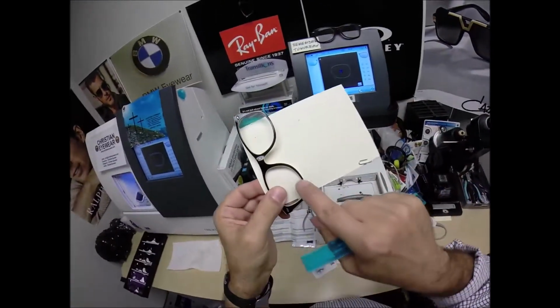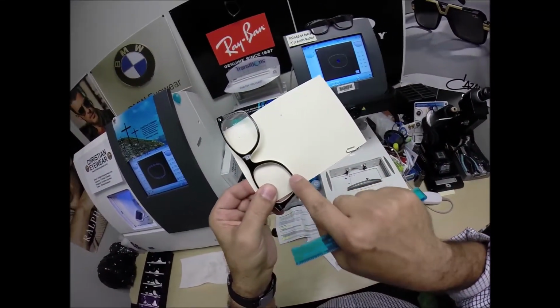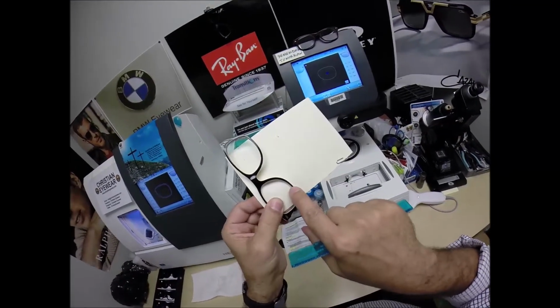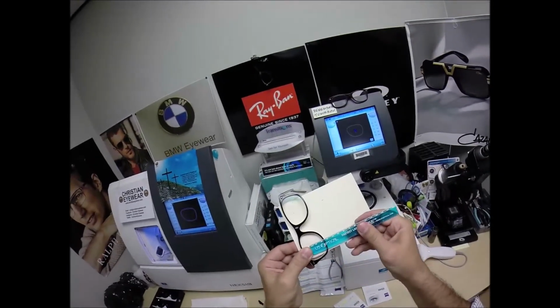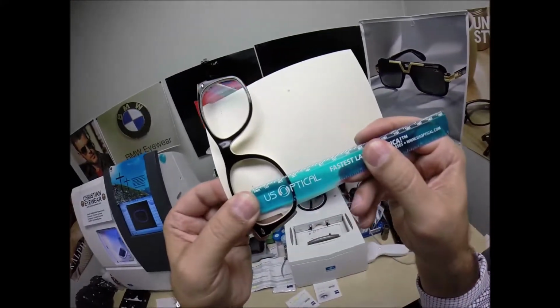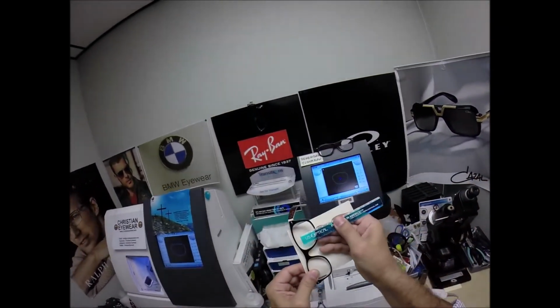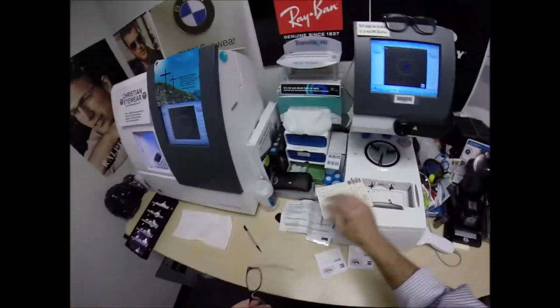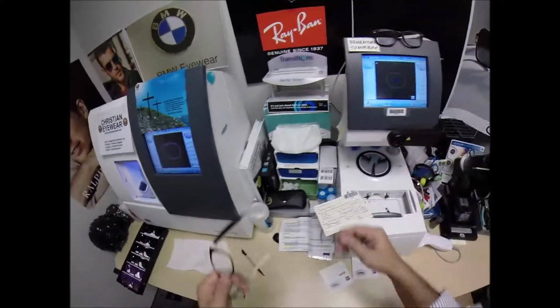So the optical center height, not to the bottom of the lens, but to the middle of the plastic, because remember, you have a V-shaped bevel on the lens that goes halfway into the frame. So when we hold it up there, we're getting 23 millimeters. 23 millimeters. Man, the kit is good. I did stay at a Holiday Inn Express last night.